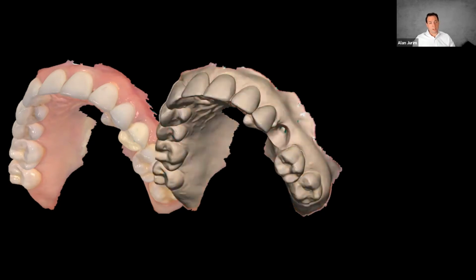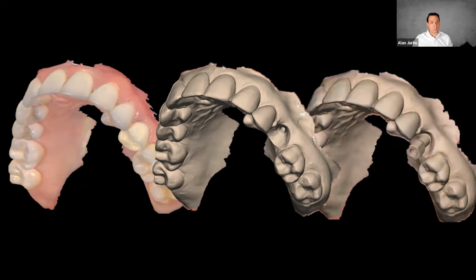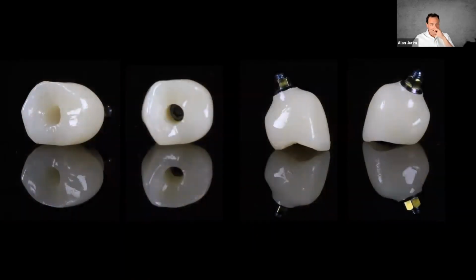And look, when we create the final restoration, how we've already done one of the most important parts, which is restore the gingiva before we actually restore the tooth. So the gingiva has been formed nicely, and all of this comes back to our ability to produce that surgical guide, to transfer all the information from our digital planning back into the actual patient's jawbone. So we had our final scans here, and then we go ahead and we produce the final restoration.